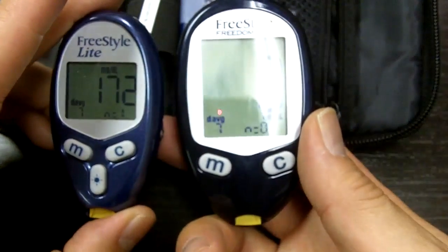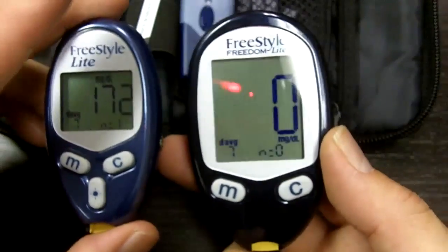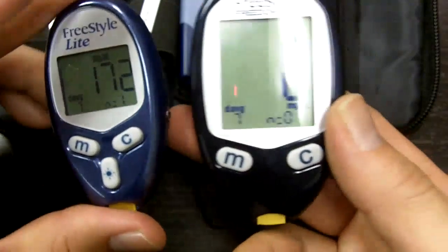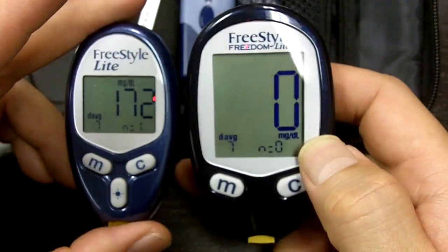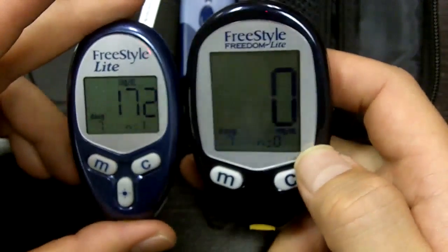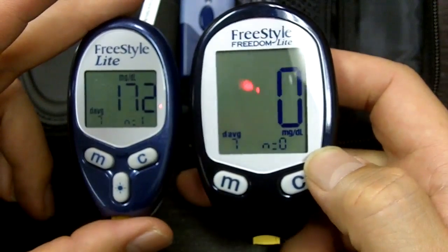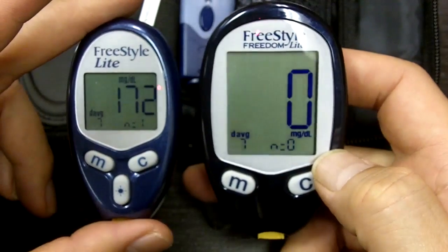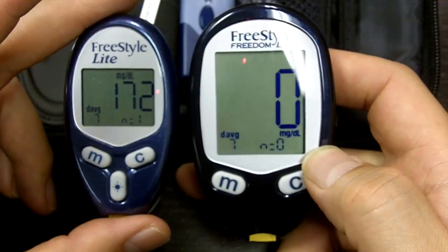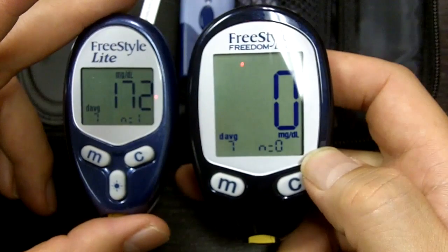It's a great meter. Depending on what your insurance is, it may cover the Freestyle — it may also cover the other meters we're going to go over as well. But these are two options that you have. Bottom line is that you do have options, and you should know about all the options and how they work. This is a little bit of information for you on the Freestyle Lite. Next episode, I'll go over a different meter for you.